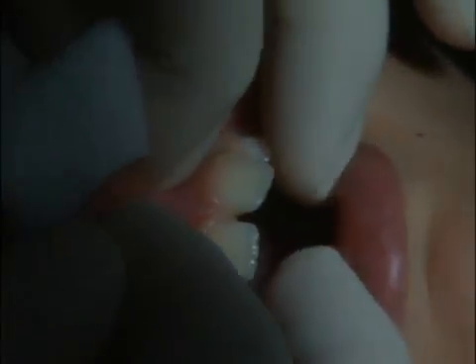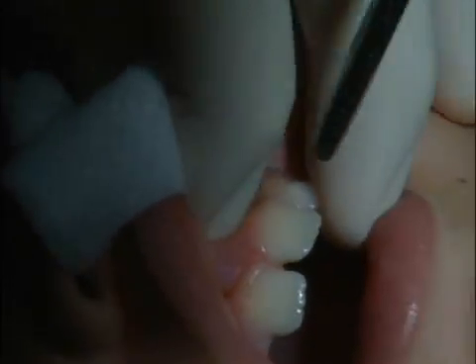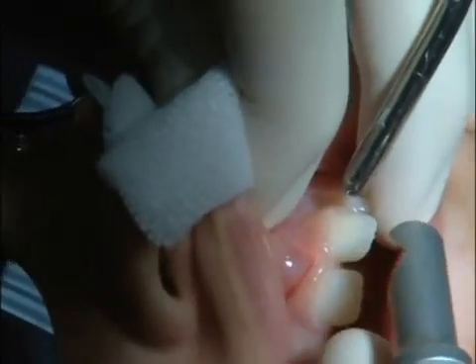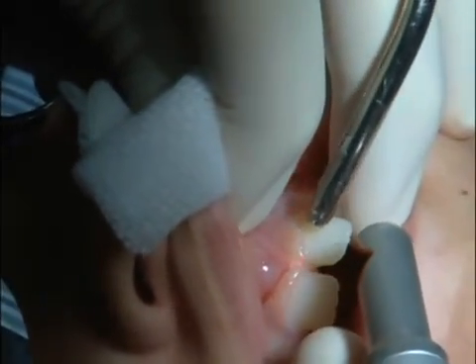You'll notice that the teeth are separated and the frenum actually goes up in between the central incisors. So what we're going to do is we're going to kind of score the tissue between the teeth.